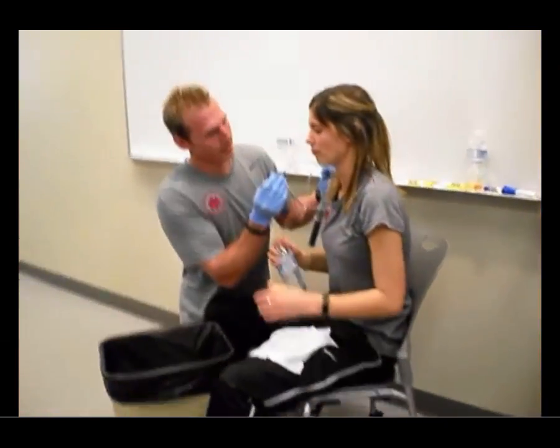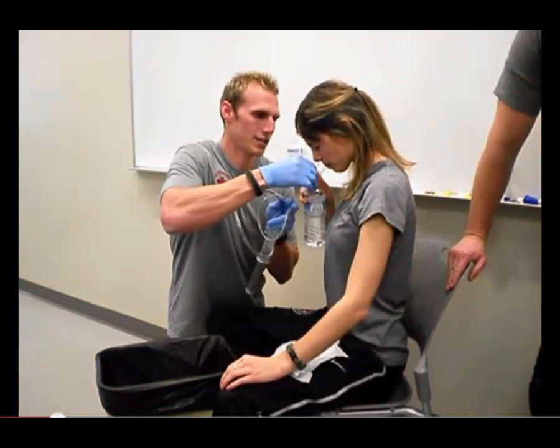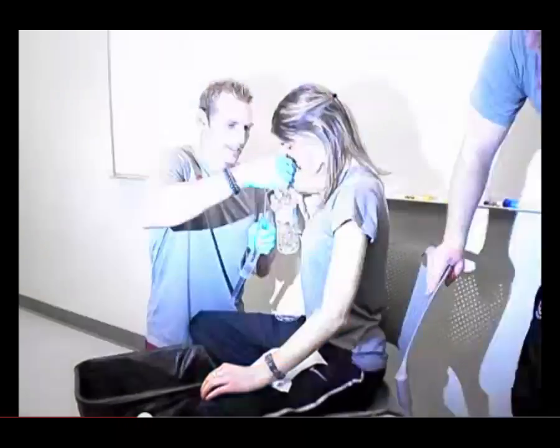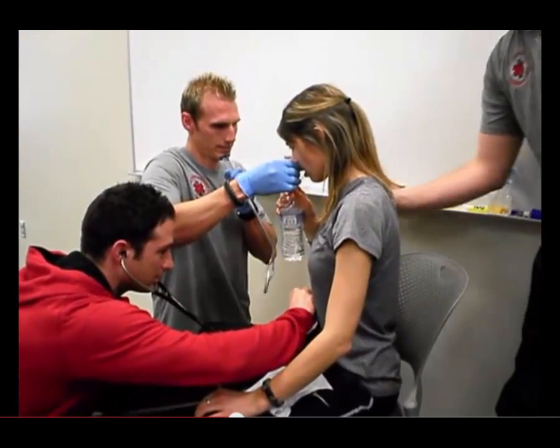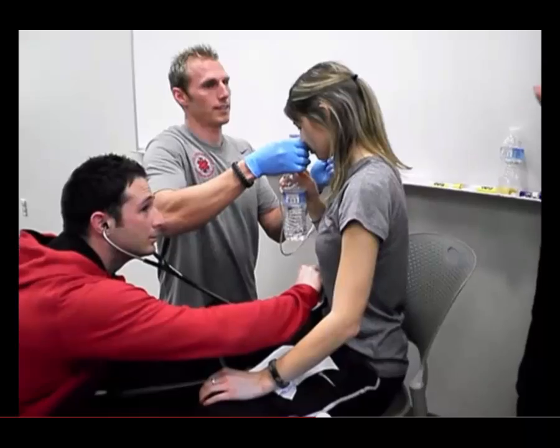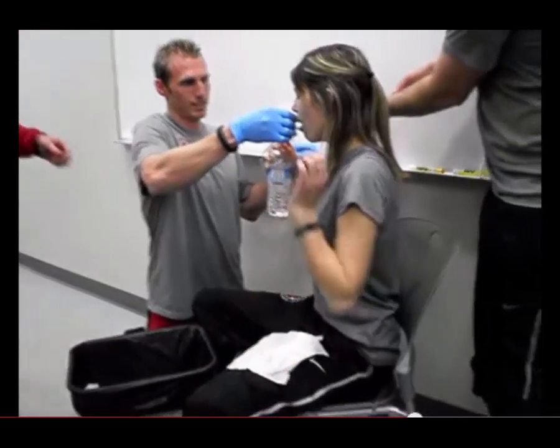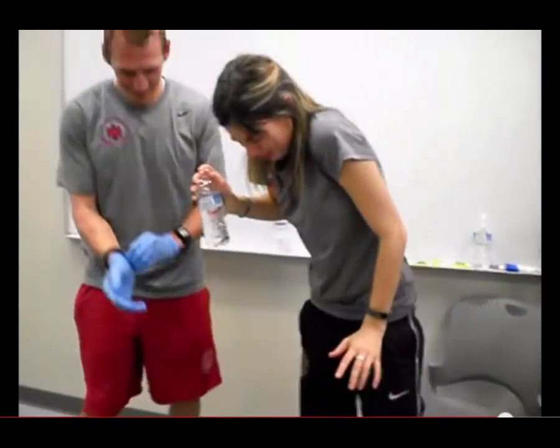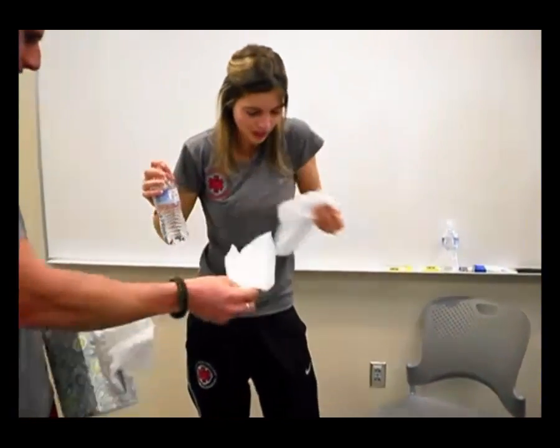Chin down. Tuck your chin. There you go. Nice. Okay, get it in there. Push it hard. Don't swallow, just breathe out of your mouth. Okay, push it hard, fast, go. Ready? Fast, plunge it. Okay, there you go. I'm going to let you pull it out easy. Nice and slow. Good job. Oh, I missed. Did you pull it out? Yeah.